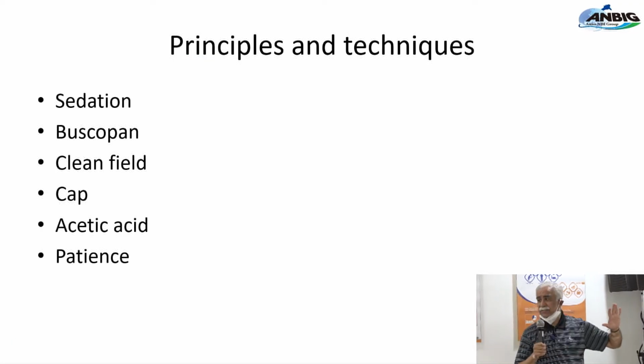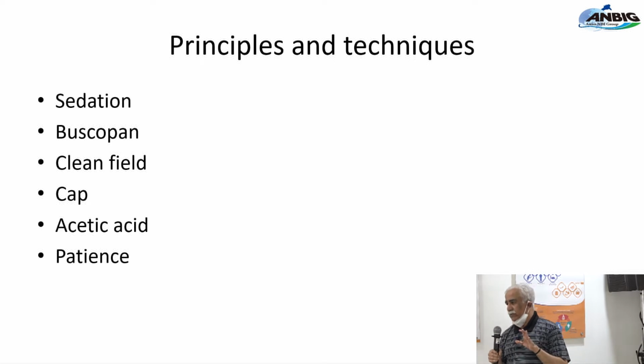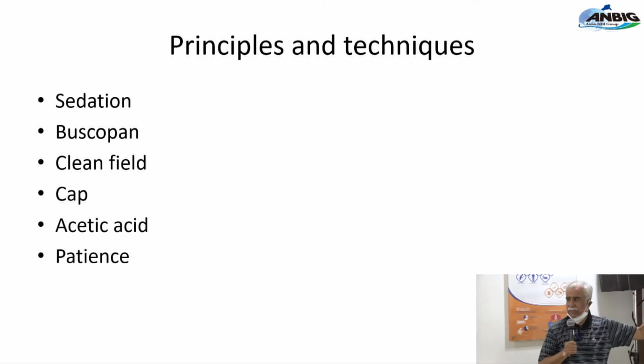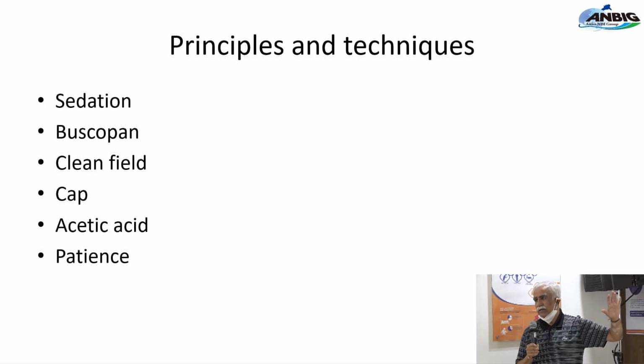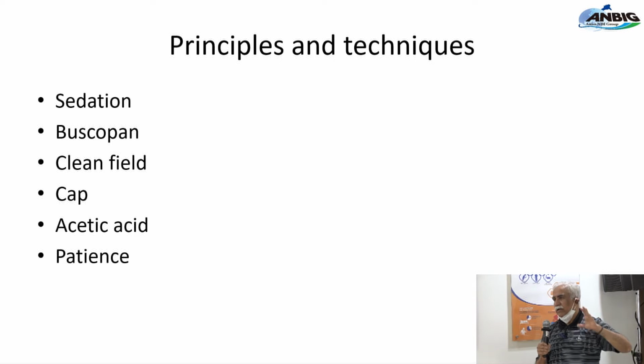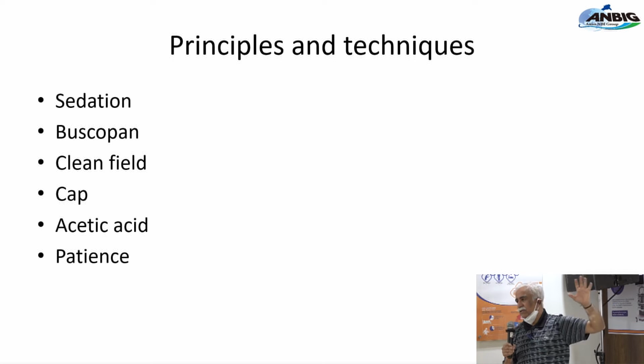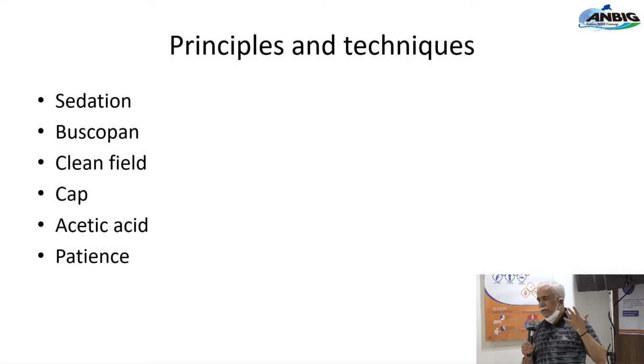So this is, I think, the most important slide for all of us: if you want to do good quality endoscopy, you must sedate the patient. A patient who is jumping around on the bed is not going to allow that, because your entire attention is going to be on whether he is going to chew up the scope. Scope damage hoga, kya hoga? You're worried about that, so one hand is there rather than focusing on the screen. Use Buscopan as and when necessary. We don't use it routinely, but yes, if we have issues, we certainly use Buscopan. We obviously want a clean field. There's no doubt about that.